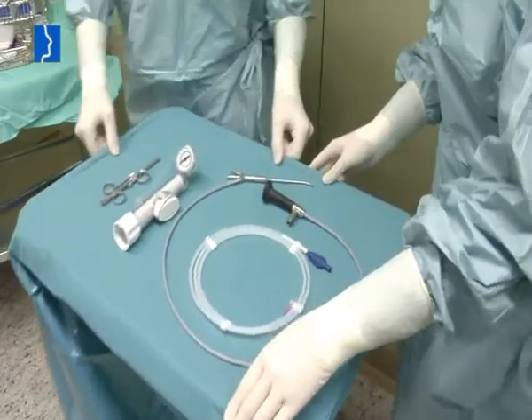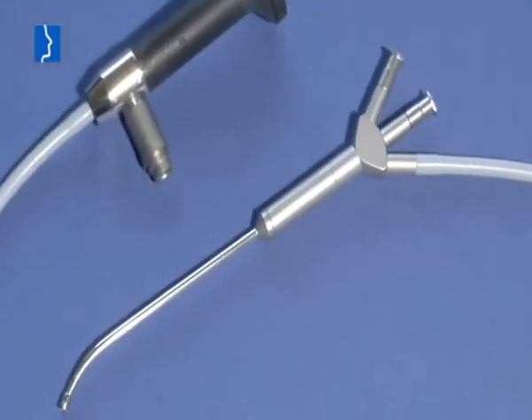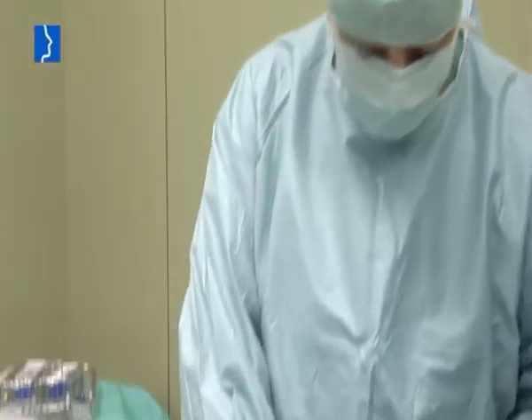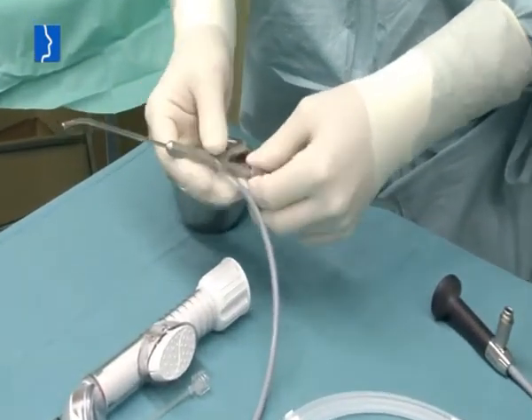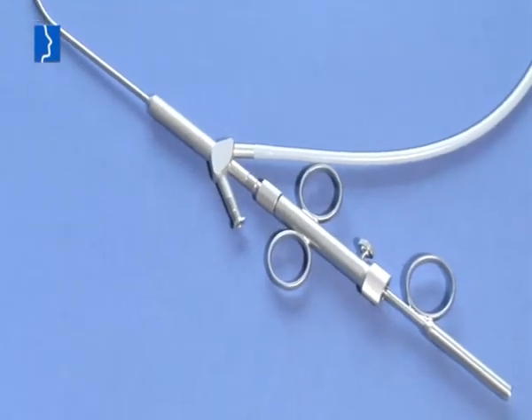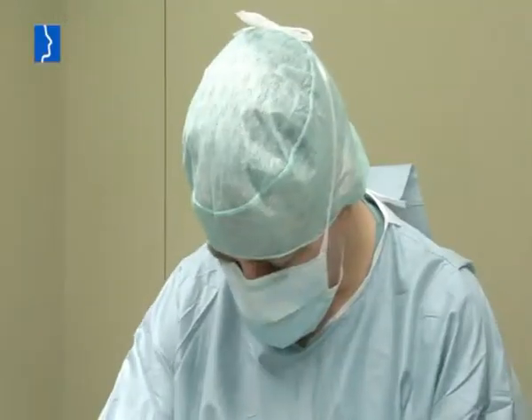The therapeutic equipment comprises 4 components. The microendoscope, specially developed by Spiegler and Theis, is designed in such a way that it allows very controlled, minimally invasive advancement of the catheter into the eustachian tube. The insertion instrument has an integrated advance indicator with a lock to prevent the catheter from entering the tympanum.